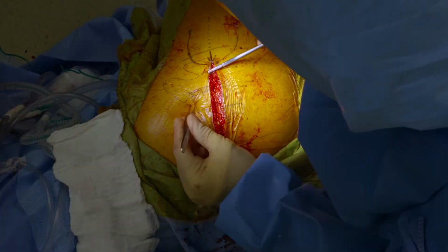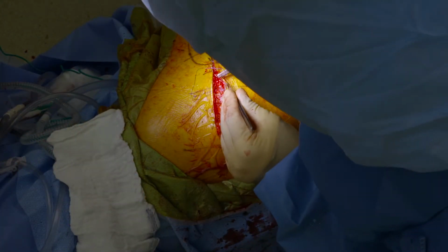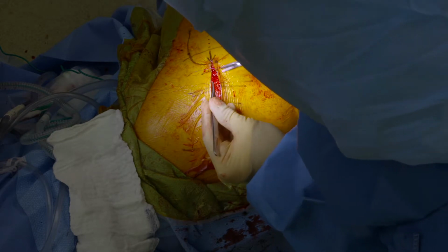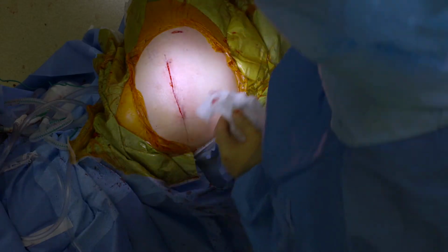The only closure really is this capsule, which is something you have to go through, but it's just an incision that you're able to bring back together and suture, which not only adds more stability, but it's more normal anatomy. So you're preserving normal anatomy and not traumatizing the tissue.